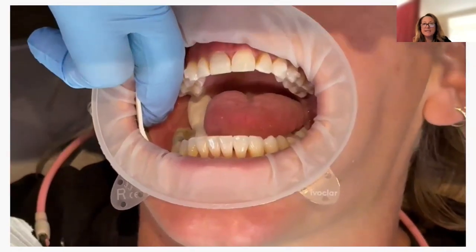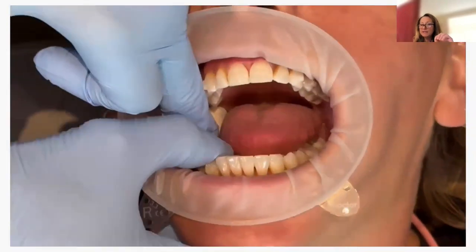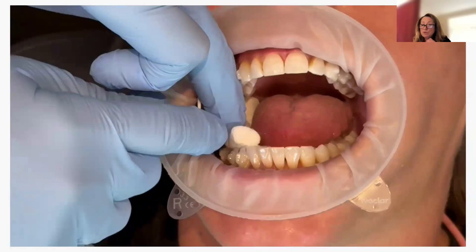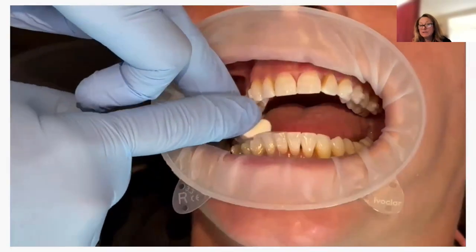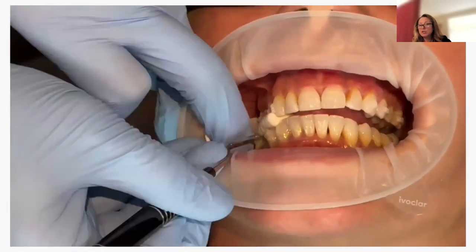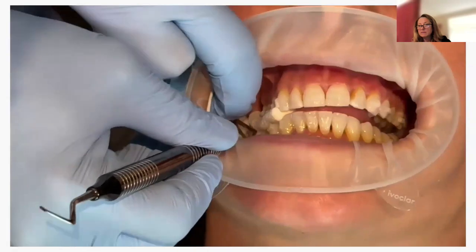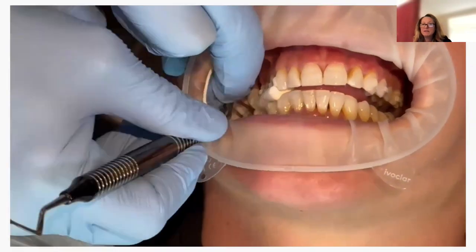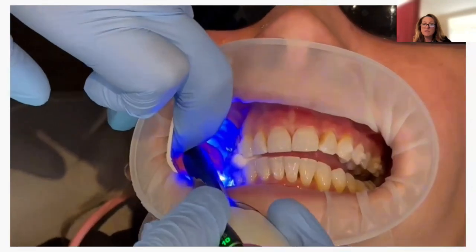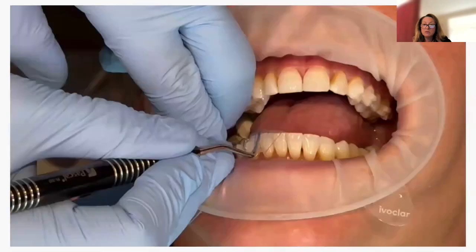And right here, you'll see where she's doing one side, but each aligner company has its own protocols. Check with whatever aligner company you are using to see. But I will usually engage so as she's pushing all that extra material away from the attachment area. And then they'll cure those. And then she'll take that off. And then he will cure a little bit more.